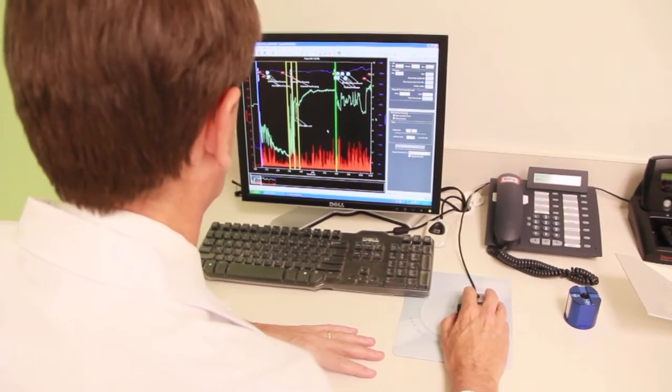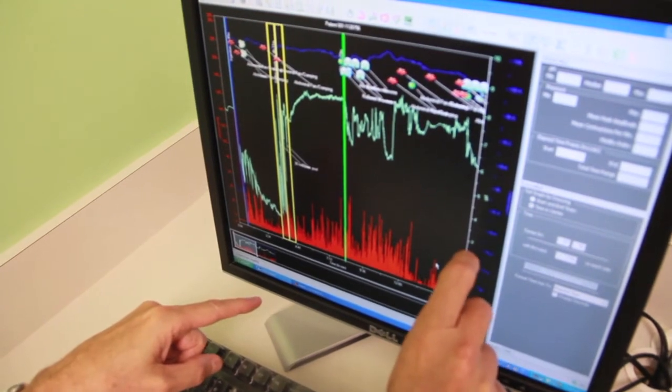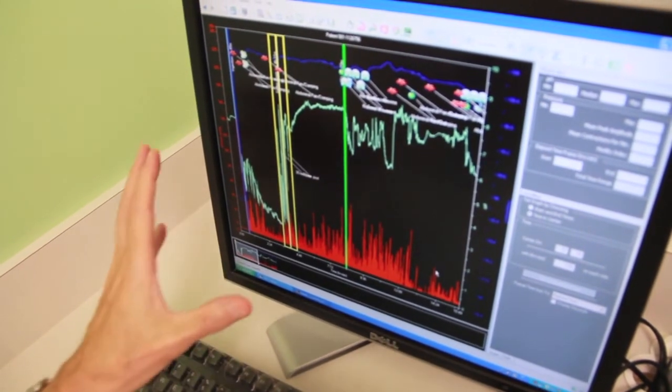We learn about the transit throughout the intestine. We learn about the transit through the stomach, small bowel and large bowel. Both children and parents are enthusiastic about it. It's as easy of a test as they can possibly have. There is no pain.